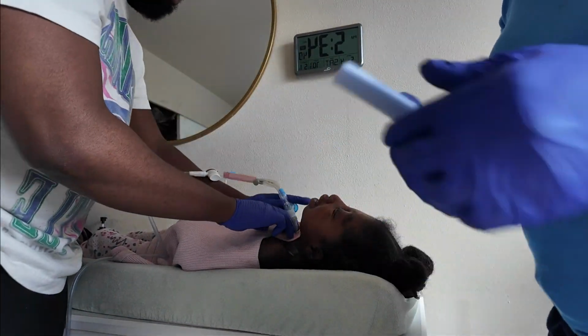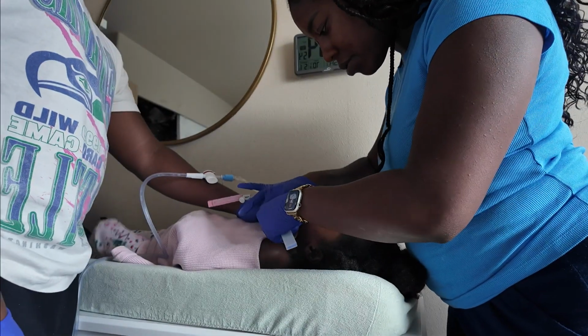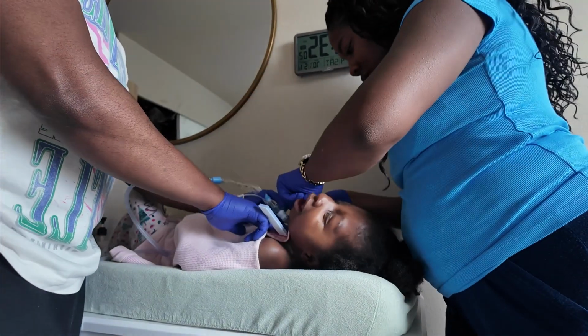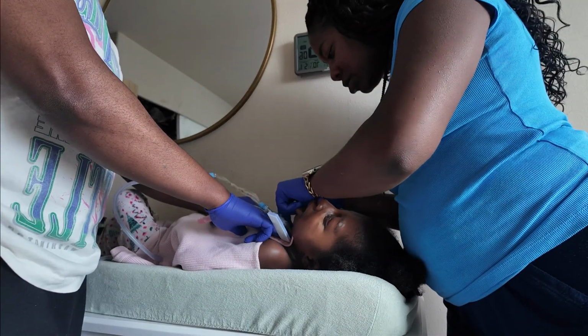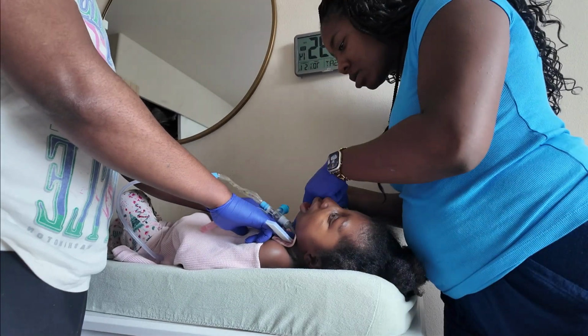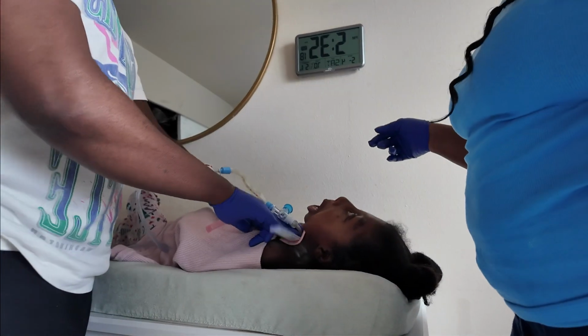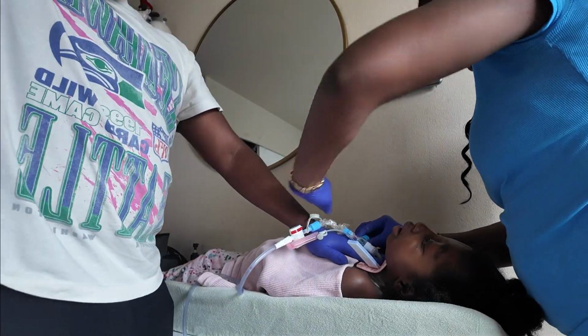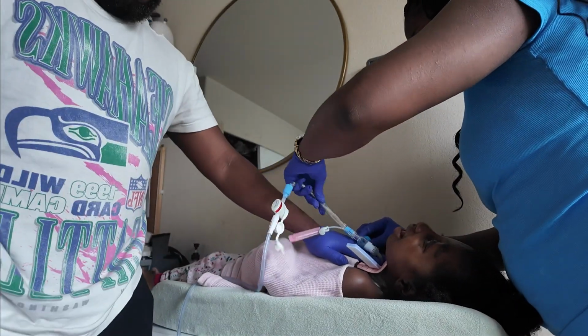So now that the dressing is on, I'm going to take each side of the trach tie and loop it through the tubing for the trach, the opening, the little flangey part. And you want to make sure that it's nice and tight and it's not loose. So I take my fingers, go through each one to make sure that it doesn't lift up because you want them to be really secure.